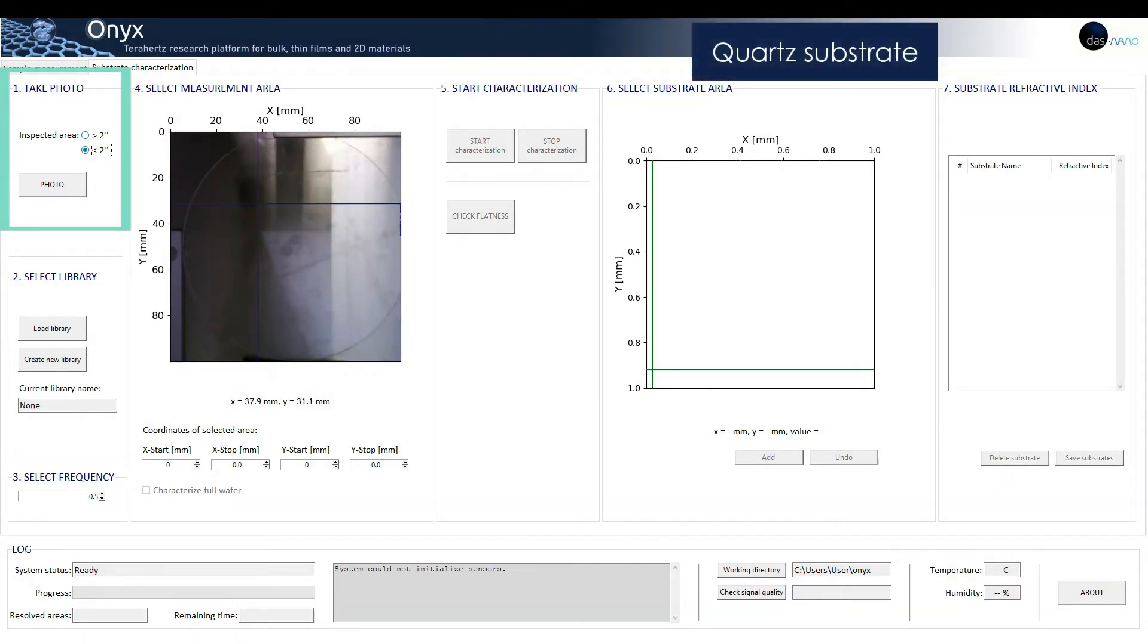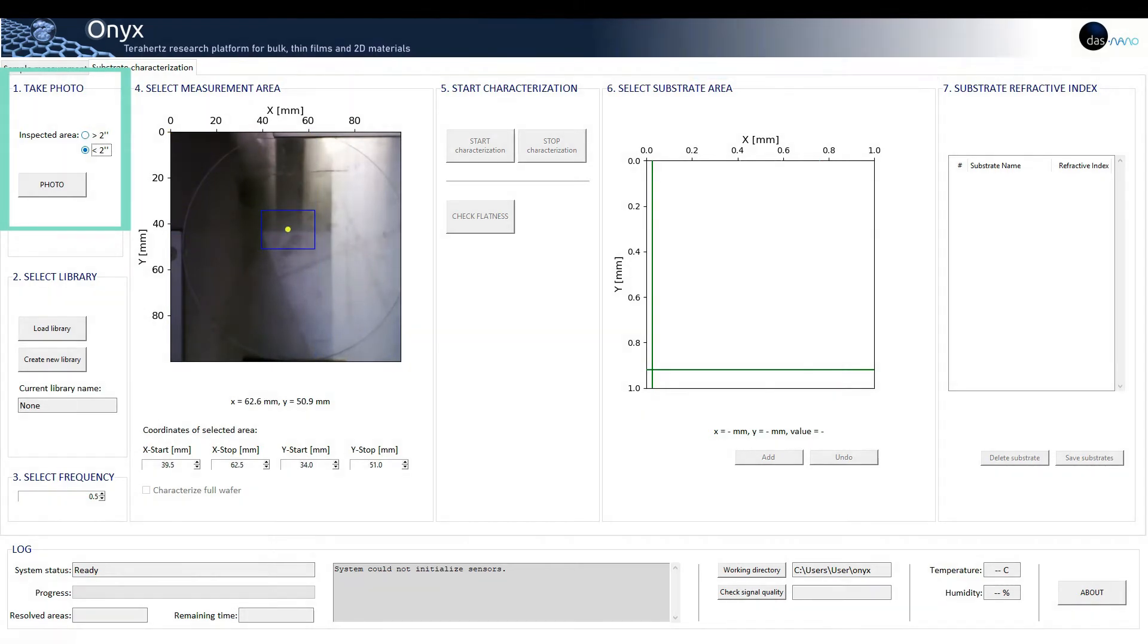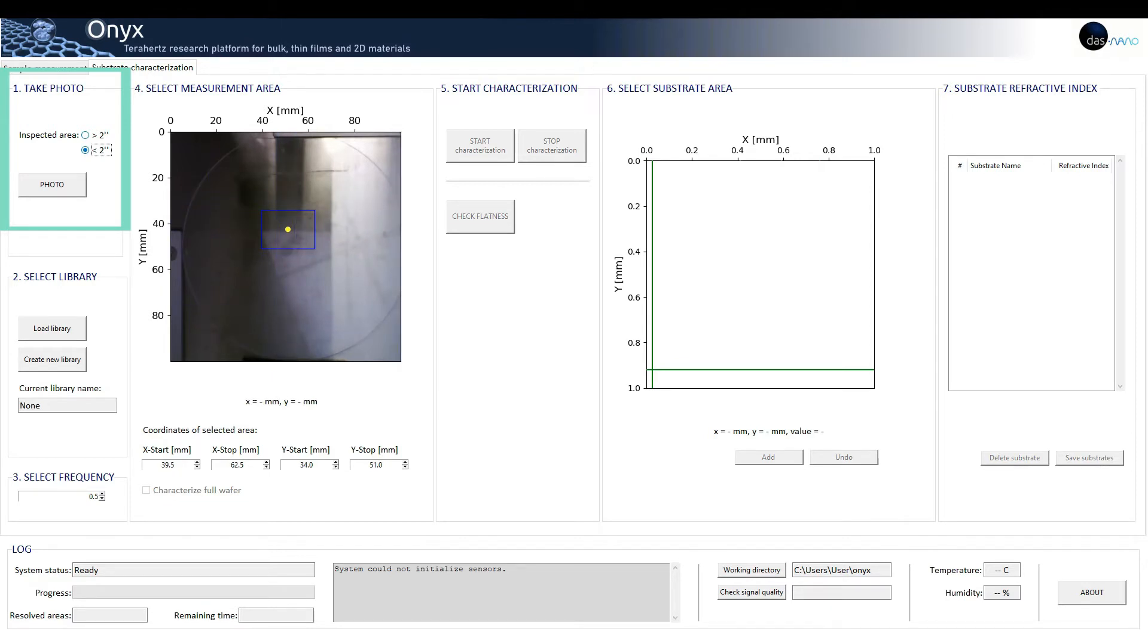ONIX system has a camera to improve the user experience and facilitate inspection. The user can select two photo sizes depending on the size of their samples: smaller than 2 inches or larger than 2 inches.